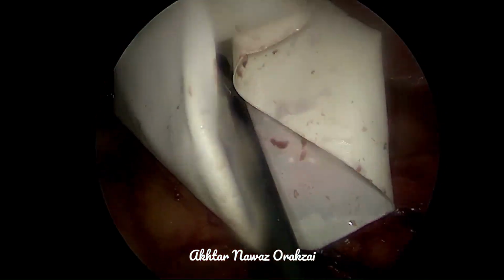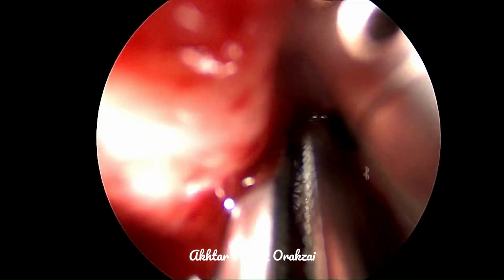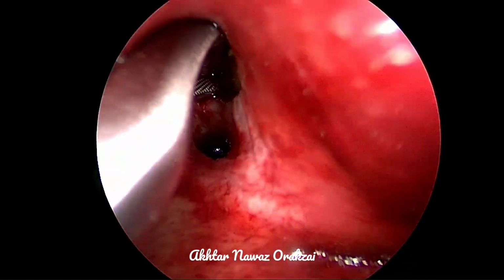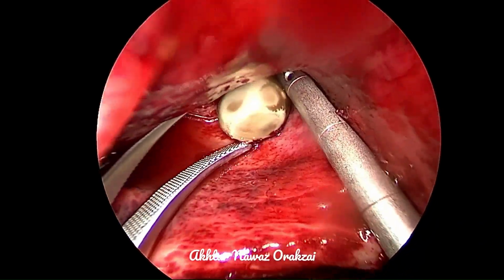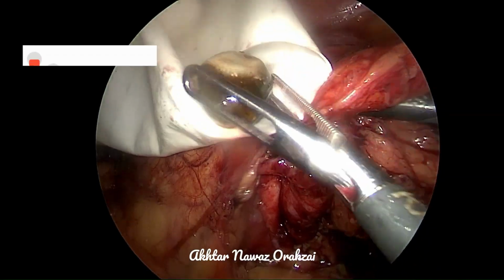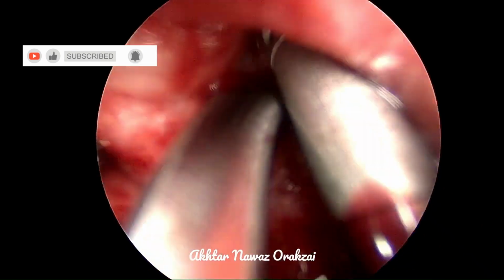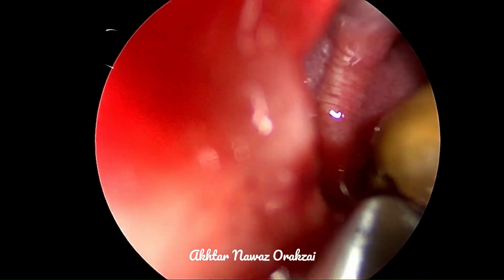These two stones, stone number 1 and stone number 2, were easily removed. However, this calyx was directed lower down and it contained 3 stones. So the first stone was removed with a little ease. This is the third stone. We actually counted 5 stones on the CT, so we have to complete the count. Otherwise, we'll have to go for operative fluoroscopy.